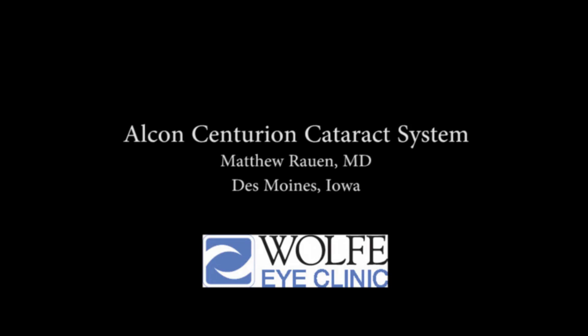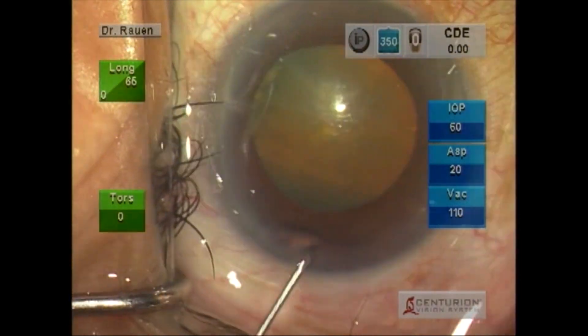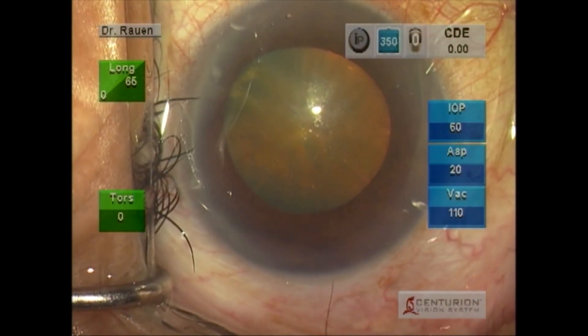Hello, this is Matt Round. I'm going to show a brief video outlining my early experience with the Alcon Centurion cataract system. I think this is a system that leads to a more efficient and safe procedure, and I believe it'll make a difference for our patients. We begin this procedure in a patient with a history of Flomax use.